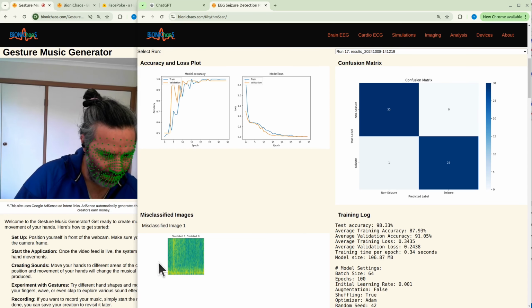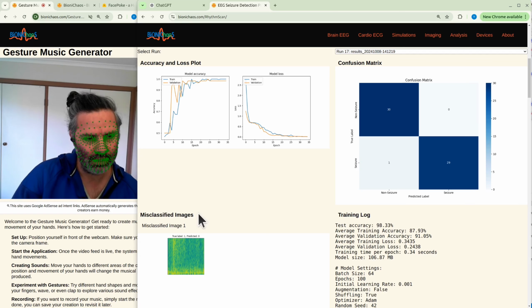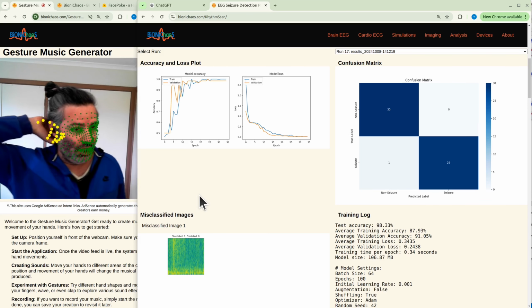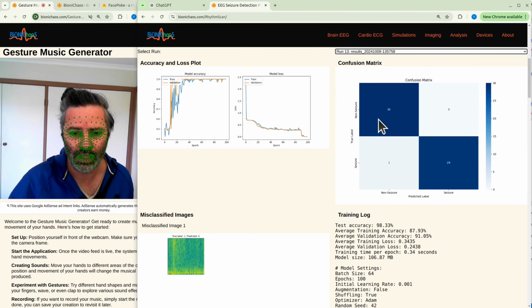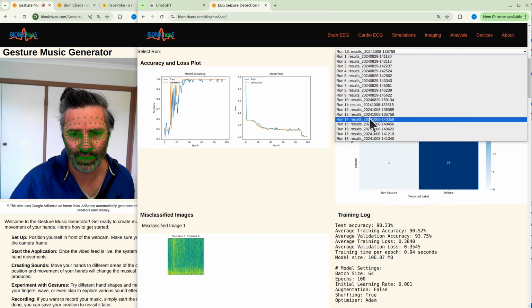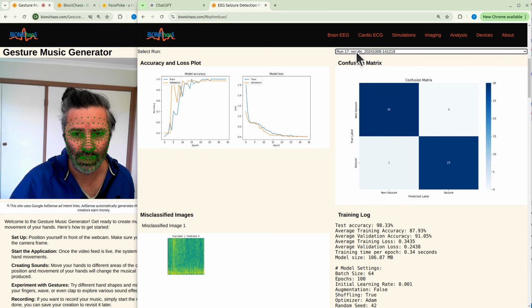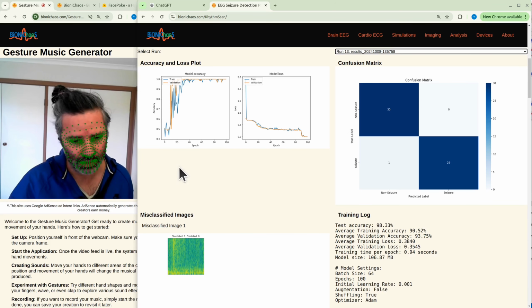Yeah, I can't see anything special in the spectrogram, so I would have misclassified it myself. But if you are an expert in EEG, epilepsy EEG, then do let me know what you think. Another thing we want to check: say run 13, which also had one misclassification, and run 17, will they have the same image being misclassified? Then that's just a hard one.